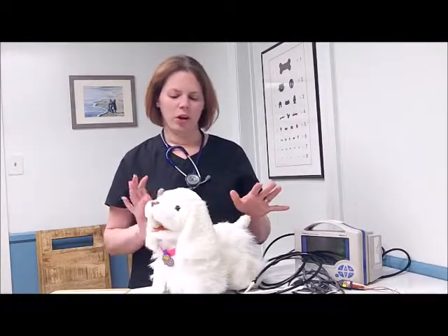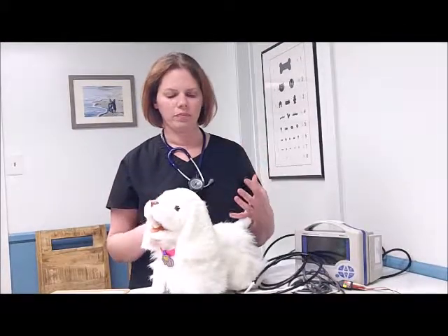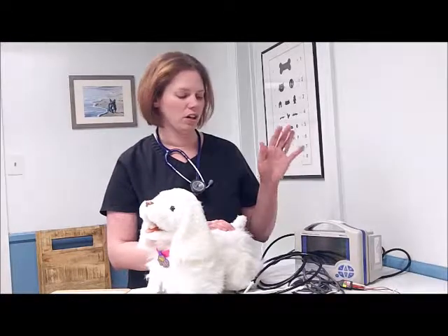It's really important to use all of these different monitoring devices, whether you have the equipment available or just your own eyes, ears, and hands on your patient at all times, just to make sure that you are monitoring and changing things appropriately. You're alerting the doctor when you need to. If things have changed on our ECG, there's an abnormal rhythm that needs to be addressed.